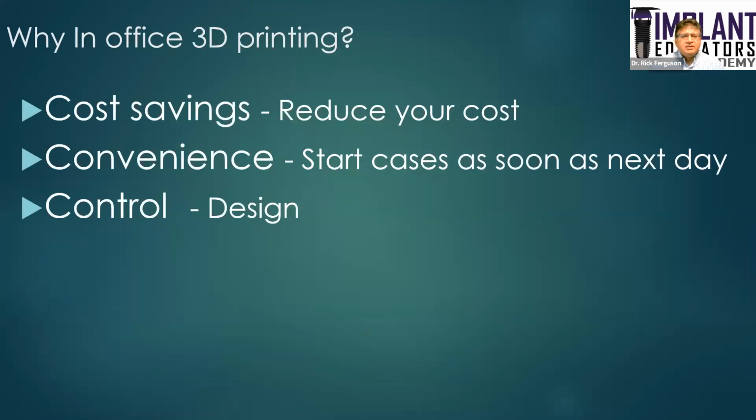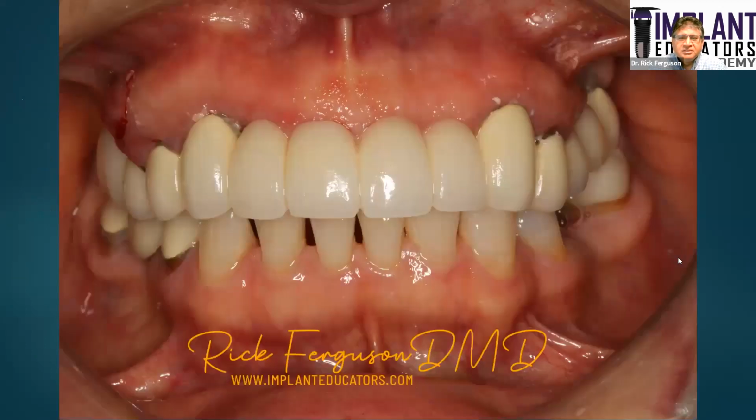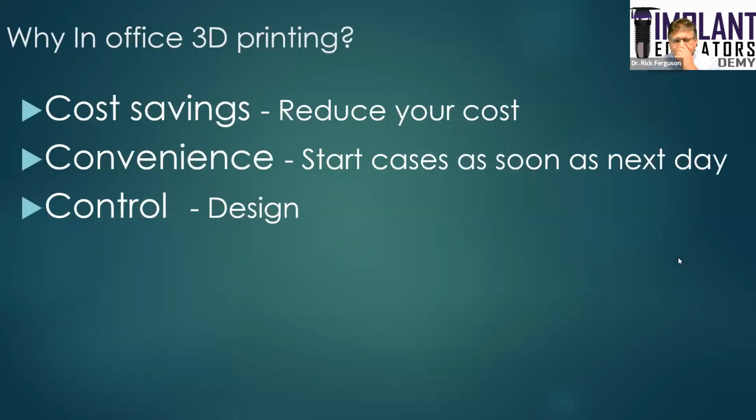All right. So just to summarize, and I'll finish up with one additional case, which is why in-office 3D printing? We are doing it, of course, to reduce our costs. More than anything, it's the convenience, so we can start cases very quickly. And then for me, a lot of it is control. I am very happy to be able to change things and do things very quickly.